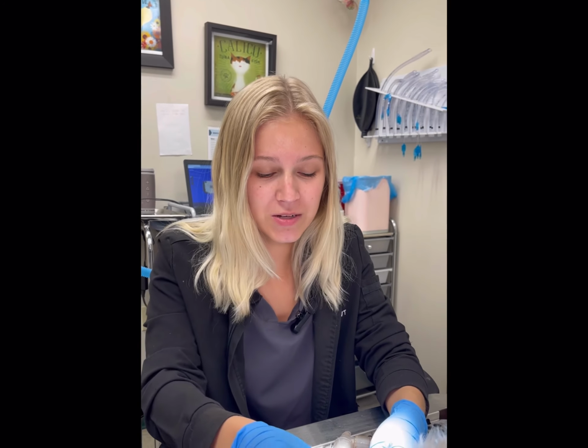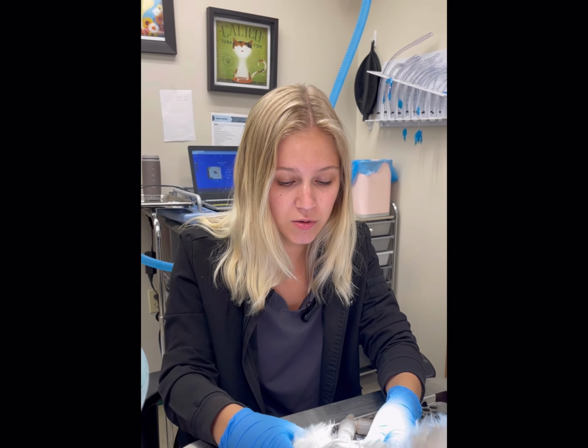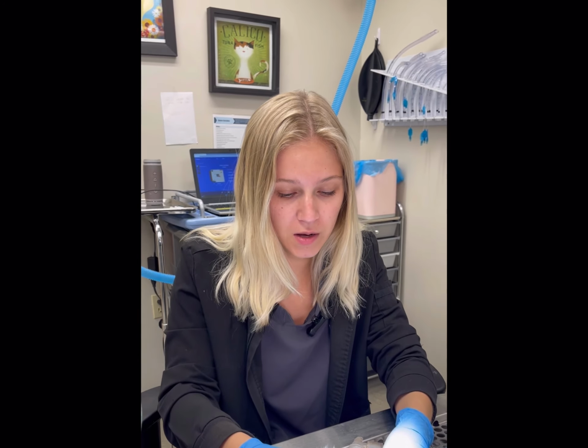Alrighty, so we have Pickles under anesthesia, so we're gonna go ahead and go through and clean off all the buildup on his teeth.